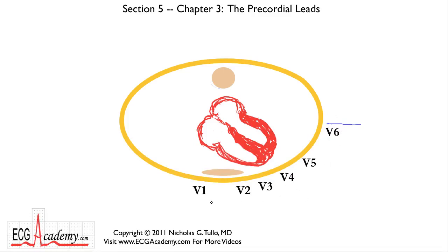And what do they record? Well, these are kind of like unipolar leads. Remember, unipolar leads are a single lead, and you're looking at voltage movement towards or away from that lead.